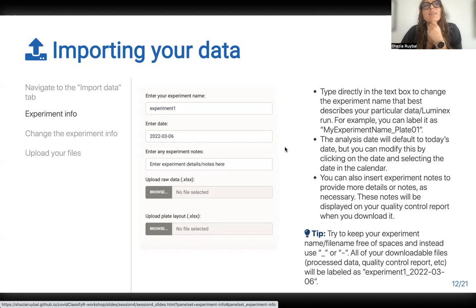So I guess the ideal scenario would be to avoid running 20 plates and then doing this 20 times. Maybe every 3 plates, or on a Friday you do this for all of the plates that you've run. I'll keep that in mind, because maybe we can just display it on the QC report anyway.